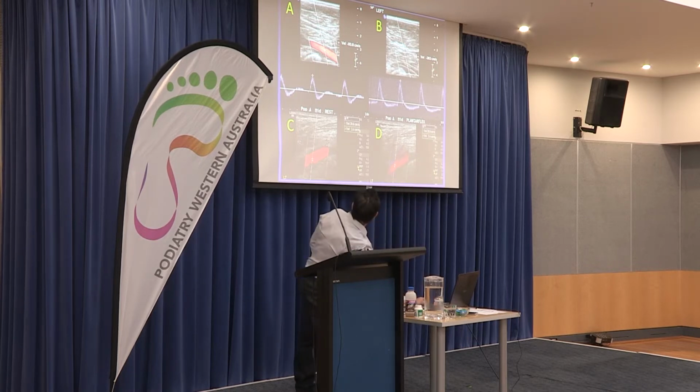And this top left-hand image is from a paper he wrote that I just showed you. That's at rest, and then after the patient does exercise. You can see how the popliteal artery is almost completely compressed by the overlying gastrocnemius soleus complex, and particularly the medial head of the gastrocnemius.